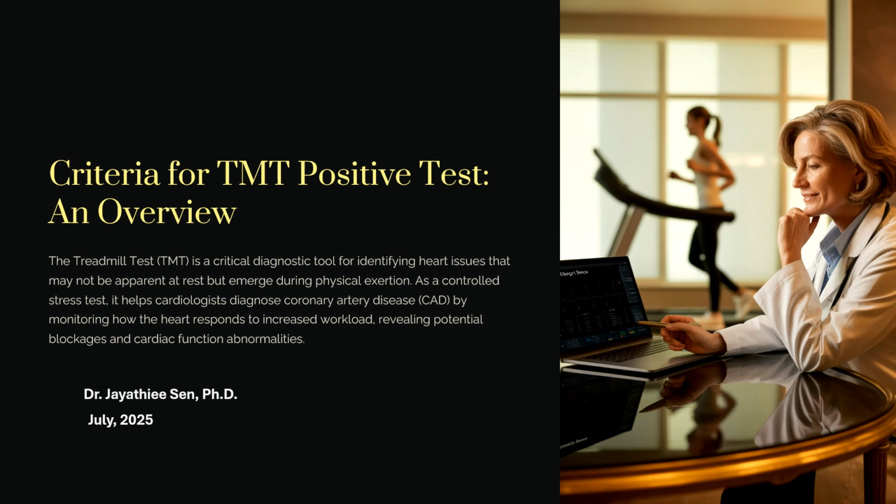Good morning, everybody. Today I am going to discuss the criteria for a TMT positive test and give an overview. We all know that the TMT test, or treadmill test, is a diagnostic tool used by various pathologists, doctors and physiologists to diagnose coronary artery disease, or CAD, by monitoring how the heart responds to increased workload.